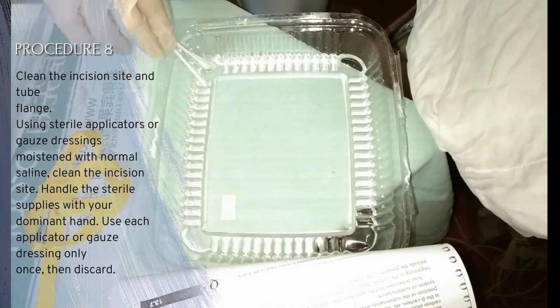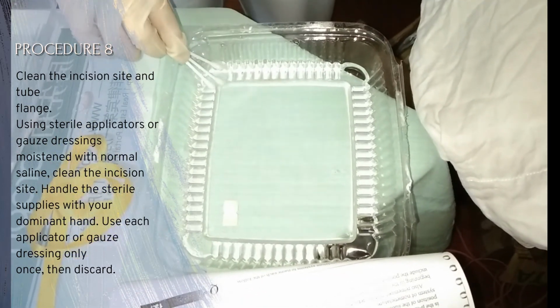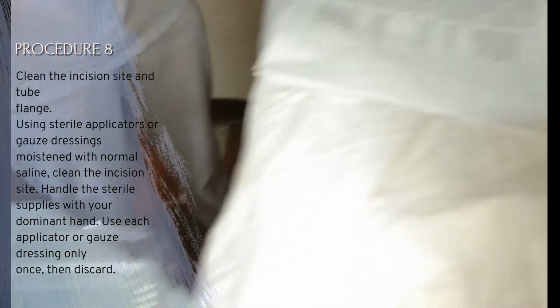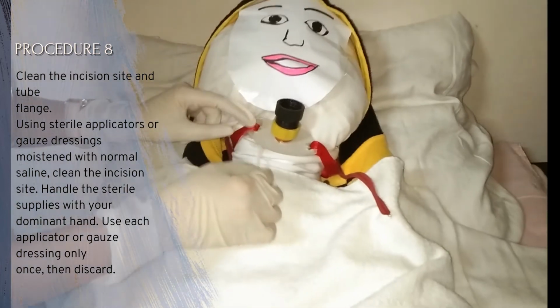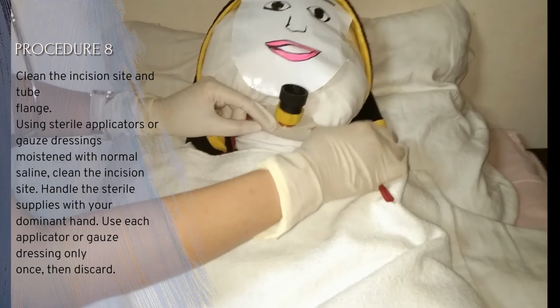Using sterile applicators or gauze dressings moistened with normal saline, clean the incision site. Handle the sterile supplies with your dominant hand. Use each applicator or gauze dressing only once, then discard. This avoids contaminating a clean area with a soiled gauze, dressing, or applicator.